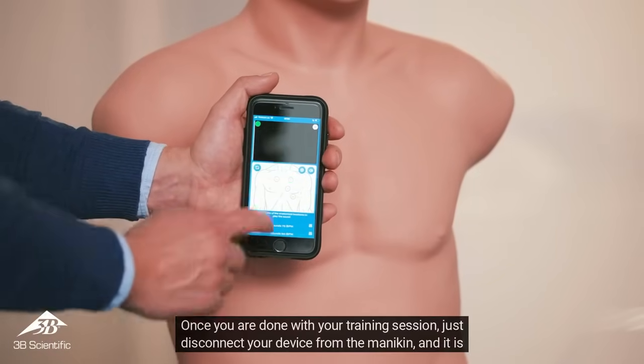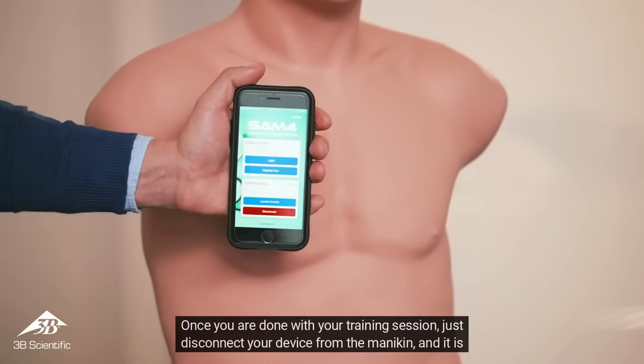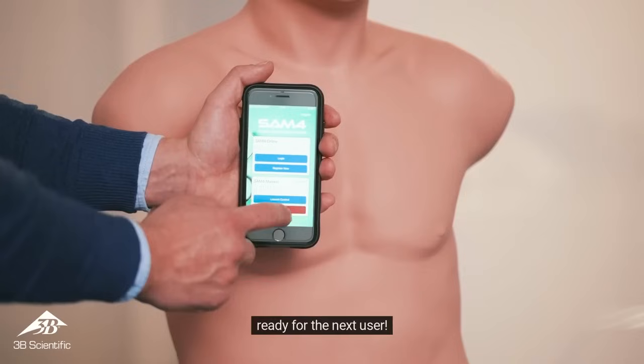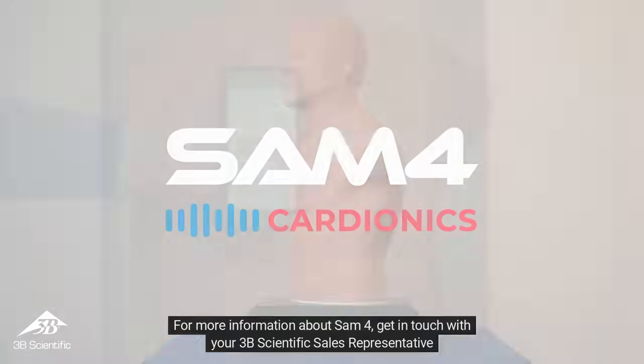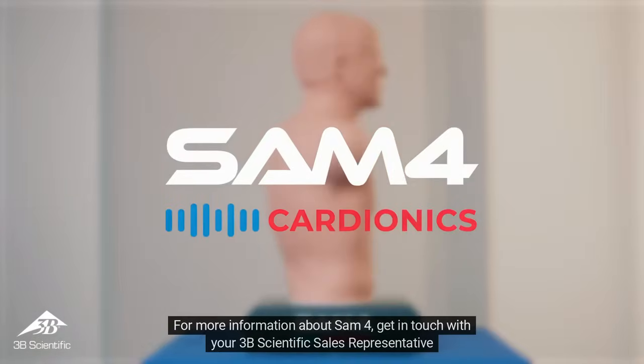Once you are done with your training session, just disconnect your device from the mannequin and it is ready for the next user. For more information about SAM-4, get in touch with your 3B Scientific sales representative.